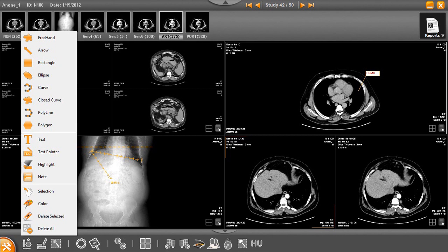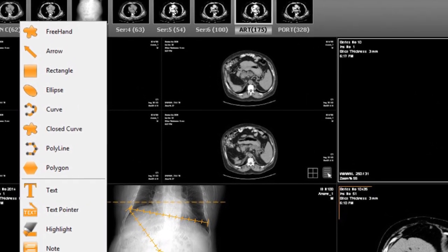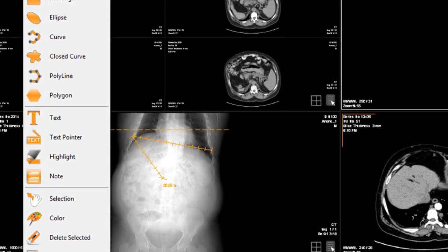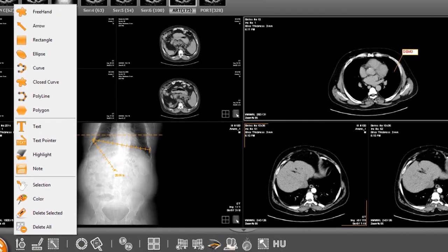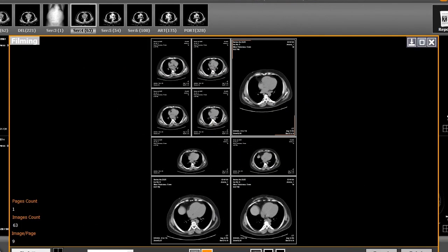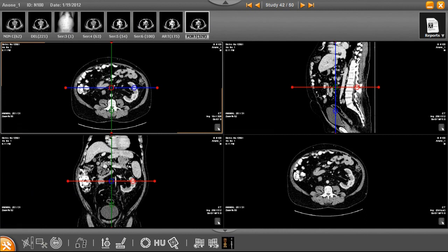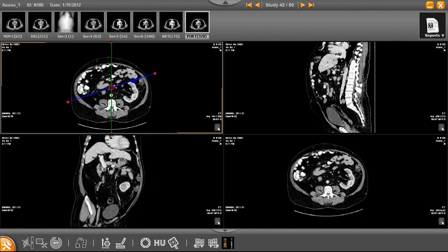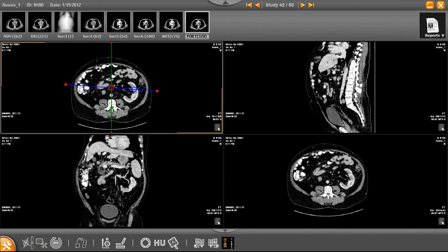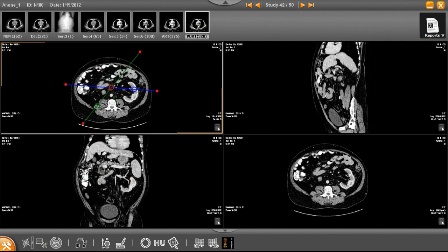The solution features complete image manipulation and advanced measuring and annotation tools. The self-explaining icons make it easy for any user to use the solution without special training. The Advanced Filming tool allows users to print selected images on Windows or DICOM printers. Advanced visualization tools, including MPR, MIP, and 3D, make it easy to navigate through large studies and improve diagnostic capabilities.